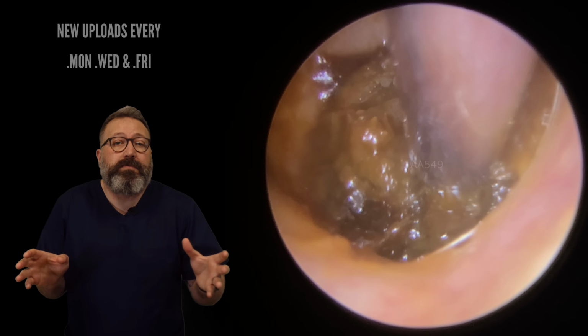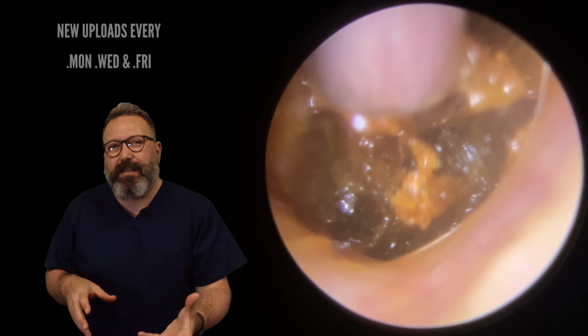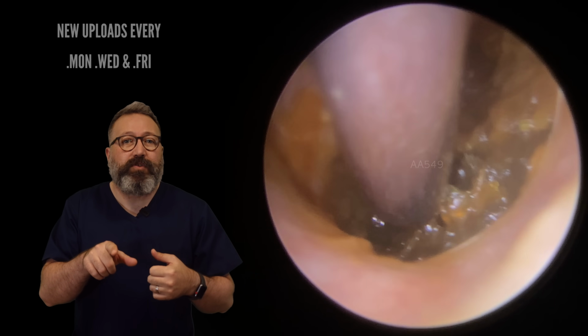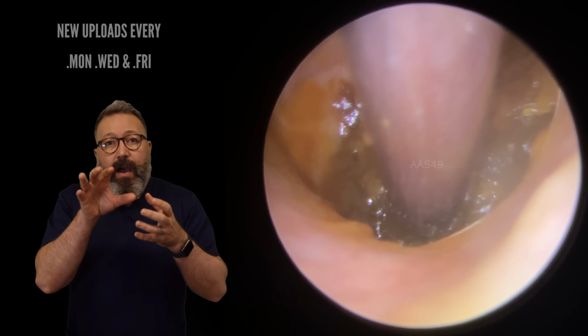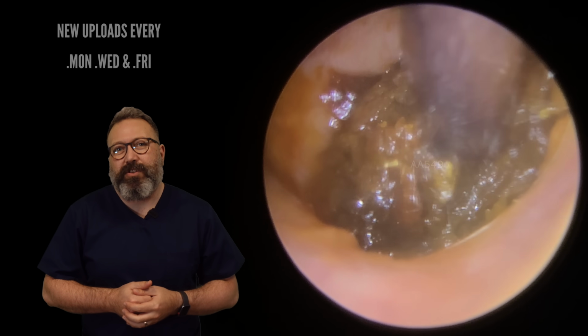Patient doesn't use cotton buds, Q-tips, nothing like that. But what we can see here is we've got this mixture of skin and wax in this particular one. Now what we do get on this one is a really good anterior recess bit of wax removal, so stay tuned for that one. So what we can see here, we've got this very deep section we're lifting. You can see the skin layers in here lifting off as well. It's all just managed to move and impact.